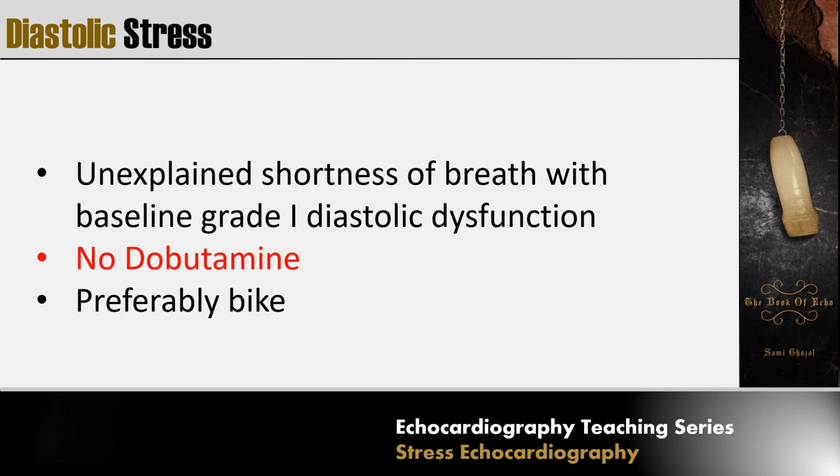Now we'll shift gear to diastolic stress echocardiography. So when do we do a diastolic stress test? If you have unexplained shortness of breath with a baseline grade 1 diastolic dysfunction. If the baseline is absolutely normal, it is unlikely that this patient's symptoms are due to diastolic dysfunction, unless he has some ischemia.